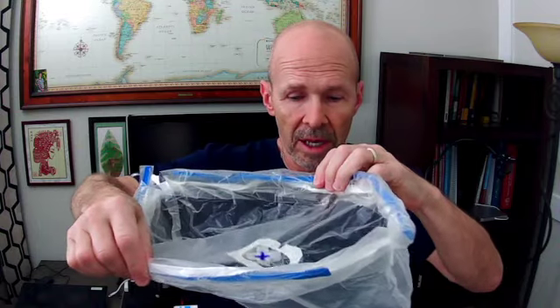So this is a rough copy of the LI Endofield. As you can see, it rolls up and goes nicely down a 15 millimeter trocar. It's patented but not manufactured yet, but when it is, it'll fit nicely down a trocar. Once it's in, the bag opens up. There are markings to orient you as to what's the top and bottom. As you can see, it opens up this way, and the metal railings allow you to shape the bag to the patient's anatomy. Now you can put it underneath the uterus or whatever organ you're operating on.